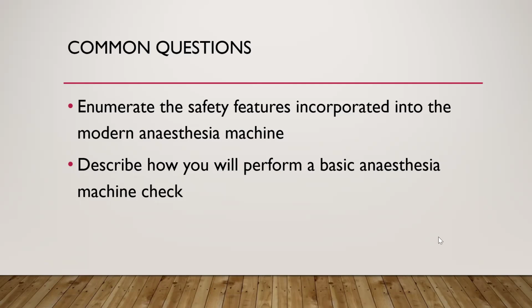Let's quickly go through it. Another one is the Selectatec system that prevents concomitant delivery of two vaporizers at the same time. Beautiful. What is it called? Yes, there's another word for it. Interlocking. Is it not an interlocking system?